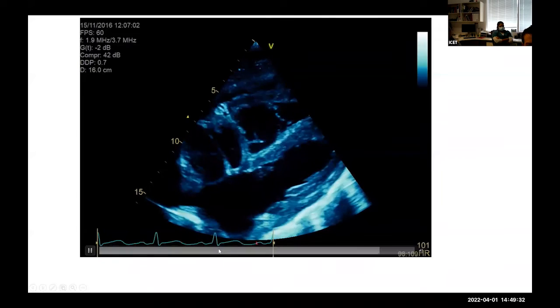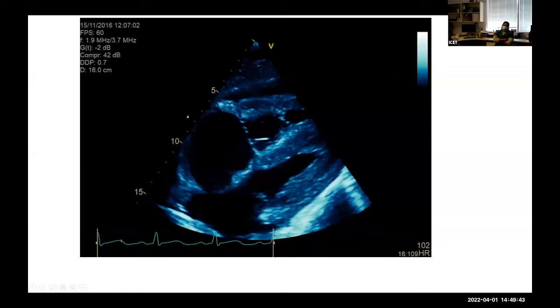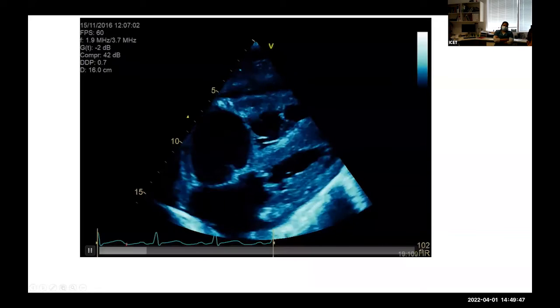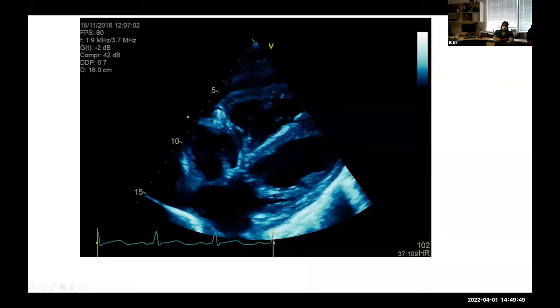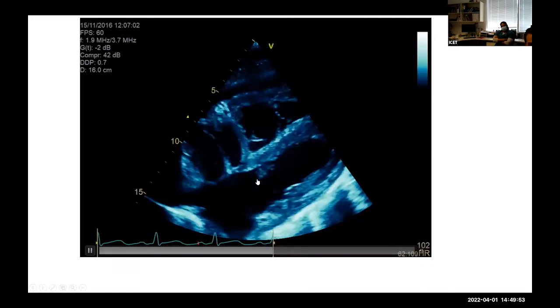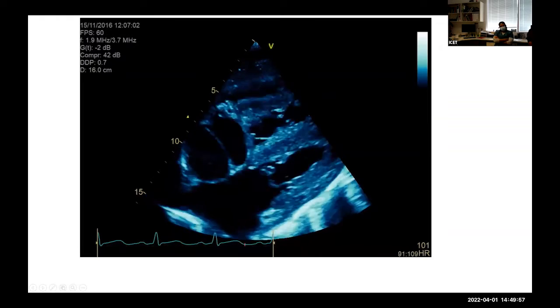And is that a lesion on the tricuspid valve? I'm not convinced that that's a vegetation on the tricuspid valve. But you note he's got quite a big moderator band, flicking in there, which I could see on that very first image. And again, here on the mitral valve, that's more suspicious, but I think I'm catching a papillary muscle and a chordae.